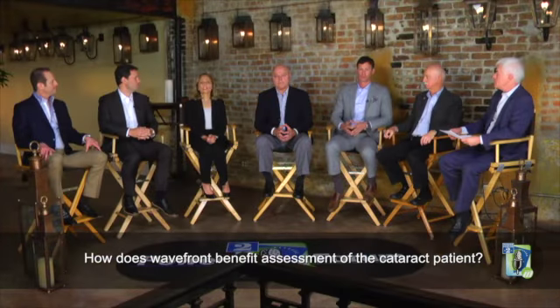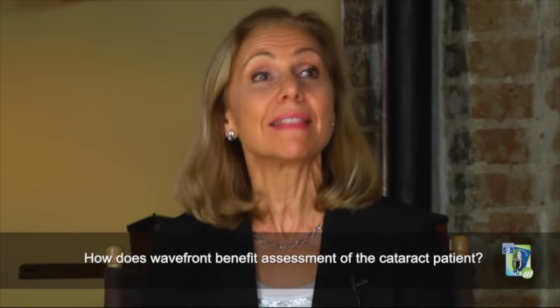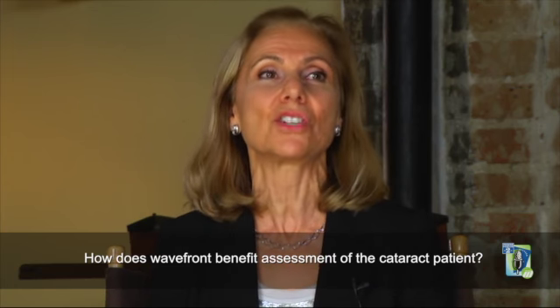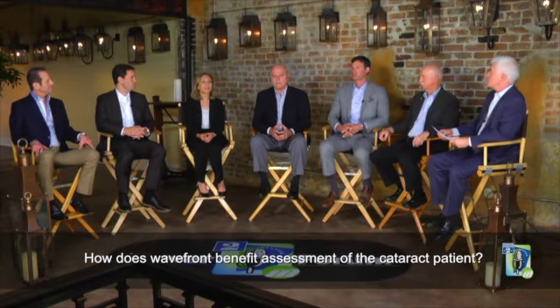What's also interesting with the OPD3 is that there's so much information that we're sharing with our patients. At times, both the patient and his or her family member who's accompanying them is totally overwhelmed. By showing them the axial maps, they kind of get the picture. They understand their disease process, their astigmatism, their dry eye condition. So it helps us help the patient make the decision for advanced technology implant or not.